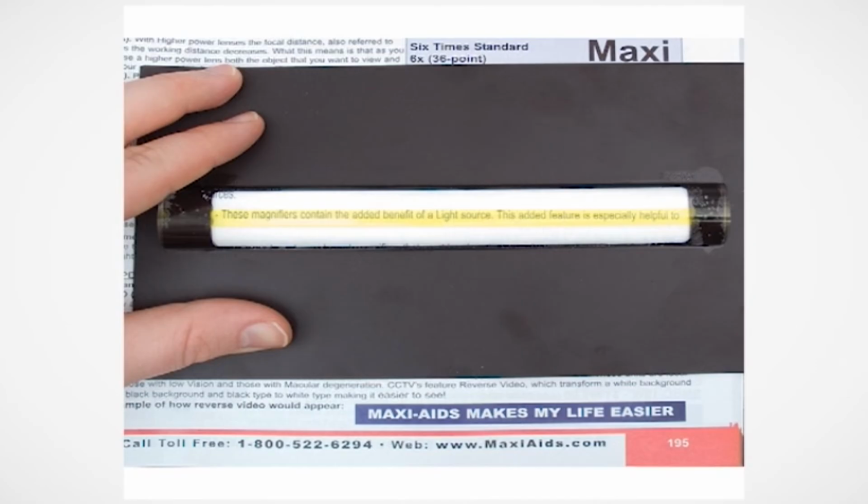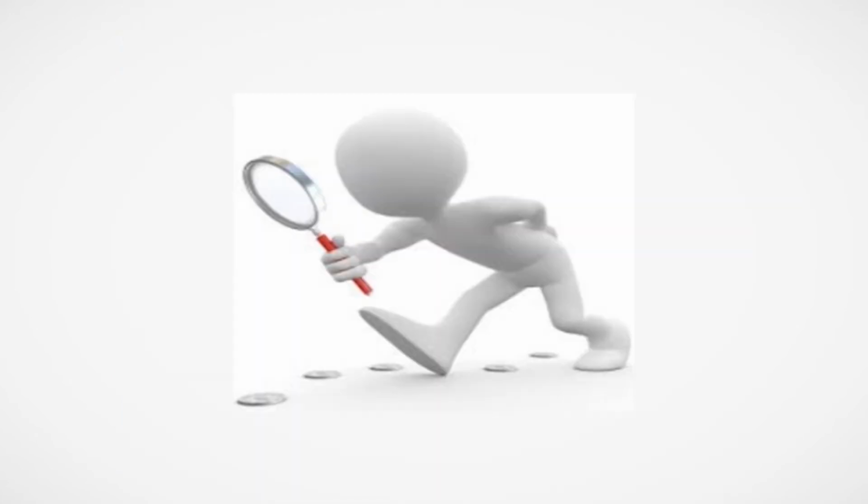Typoscope. A typoscope, or reading slit, is made up of a black cardboard with a slit in it. It is used for blocking out all but the print viewed through the slit. It should be black so that the light from the page will not get reflected. A typoscope assists in finding and keeping the place on the page of the print.